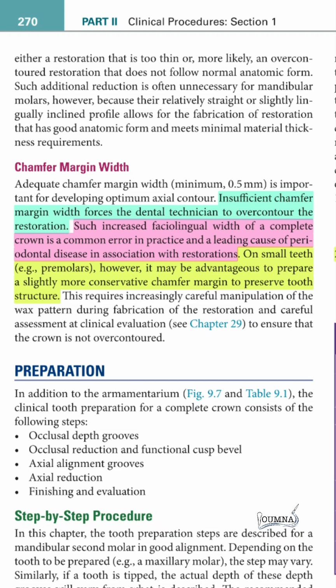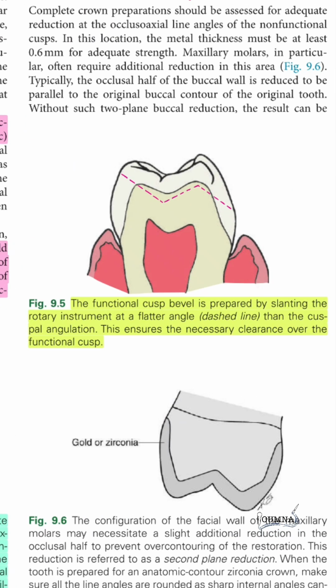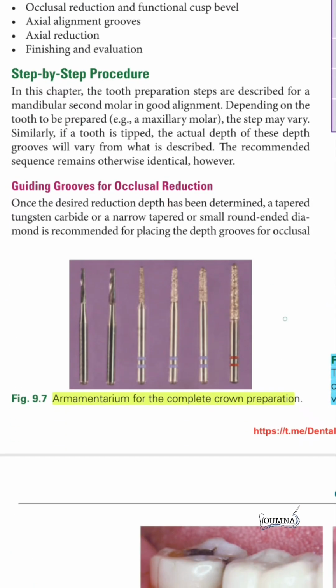If we decrease this thickness until it becomes insufficient, the dental technician will over-contour the restoration, which will increase the facial-lingual width, and it will cause periodontal diseases associated with this type of restoration. On the other hand, when we have small teeth like the premolars, it is advantageous to prepare a slightly more conservative chamfer margin to preserve the tooth structure. Also, it is important to maintain the anatomical shape of the cusps and the occlusal surface of the tooth being prepared, and to prevent a straight surface by tilting the burr in the direction of the slope of the cusp. Now let's start with the preparation.